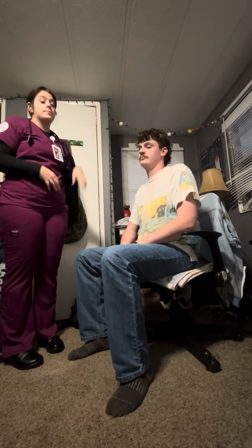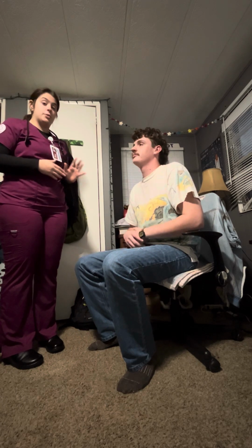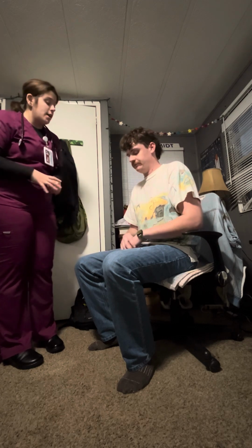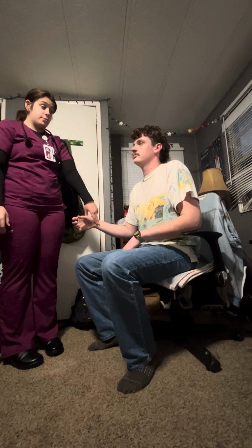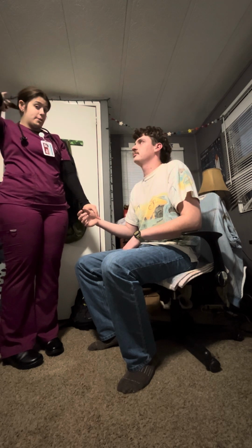I'm going to go into taking his blood pressure. The systolic should be between 90 to 140. The diastolic should be between 60 and 90 for normal sounds. I'm going to assess his pulse, which should be between 60 and 100 for the rate. The rhythm should be normal, and the amplitude should be +2.